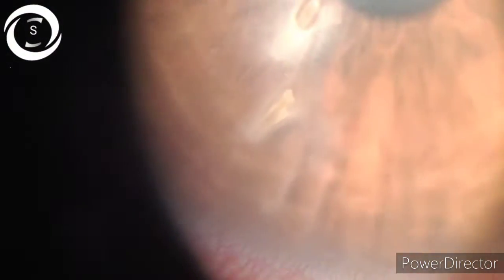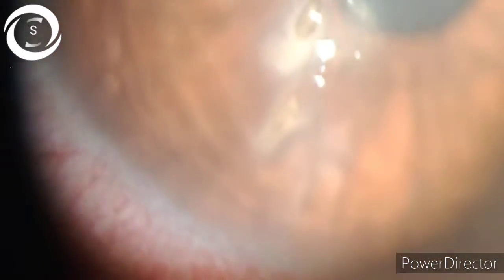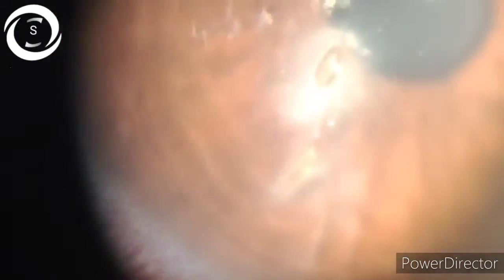Another good thing is that these foreign bodies are not fully embedded in the corneal stroma — their tips are exposed, so they can be retrieved from these tips. And if we make a pocket around their tips with a one cc needle, we can begin extraction.